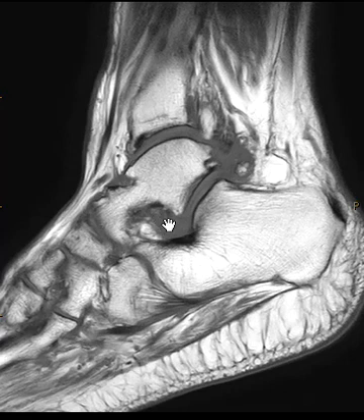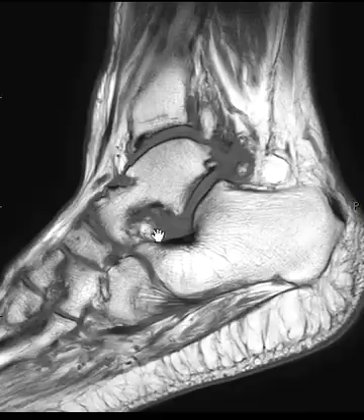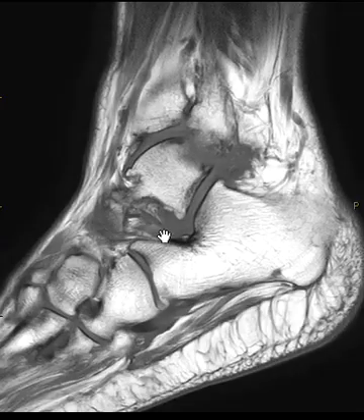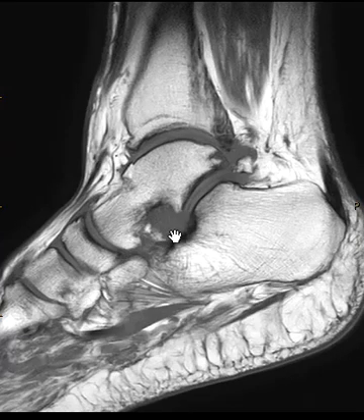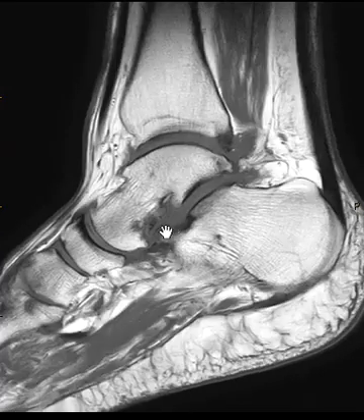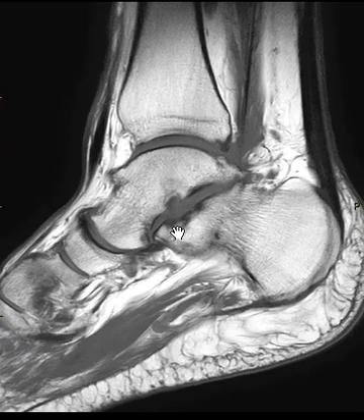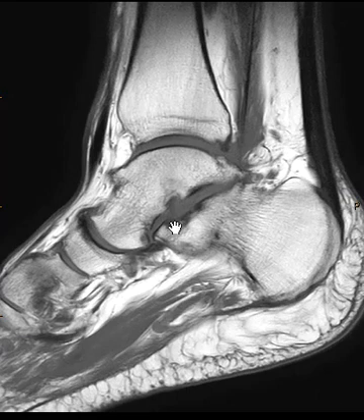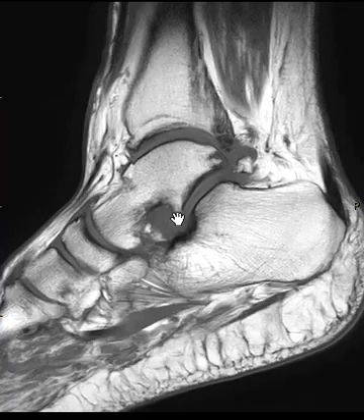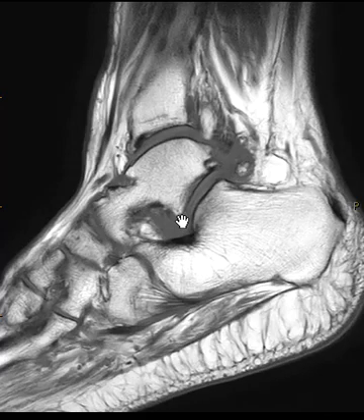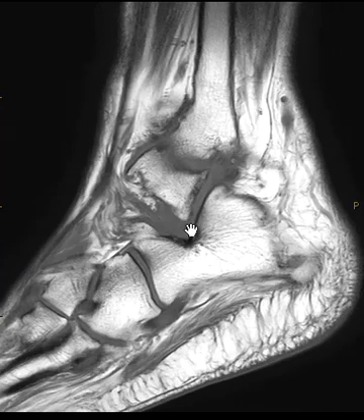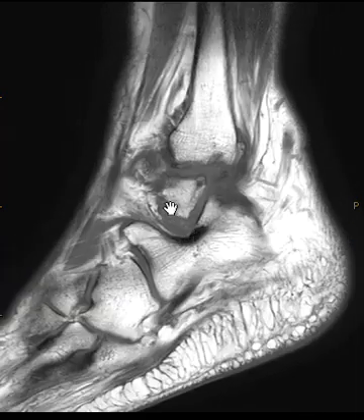You can have a varix, which would just be a big dilated vein in there, or a synovial cyst, which would be more fluid. When it's just gray and filled in like this, we think about synovial inflammation. So it looks like there's a synovial inflammatory process, and there's some little scalloping of the calcaneus and talus here, suggesting chronic erosion — more of a long-standing process.